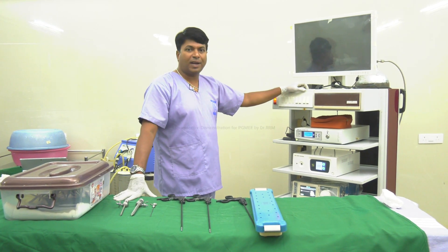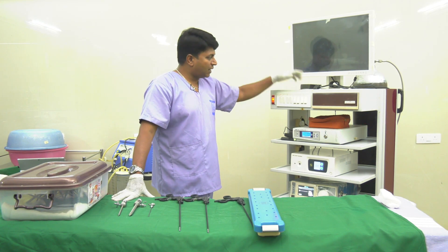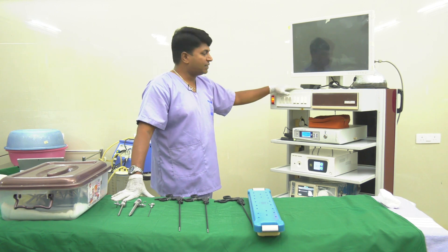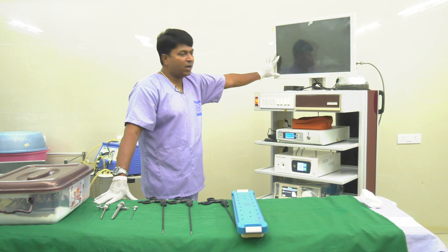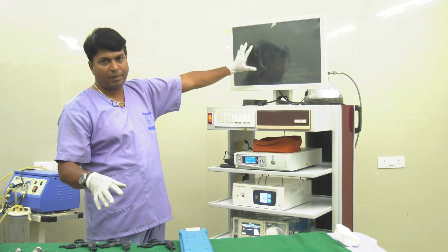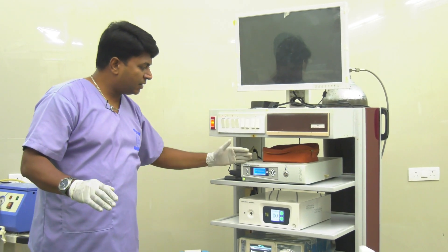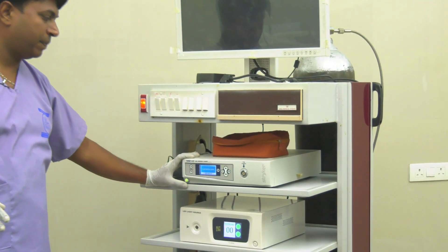Welcome friends. We are going to look at advanced technologies in laparoscopy. This is a laparoscopy instrument machine. You can see the parts of the laparoscopy machine. The first one is the monitor — this is a monitor in which we can see inside the patient's abdomen. This is a laparoscopy monitor.